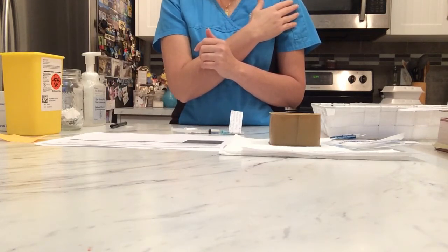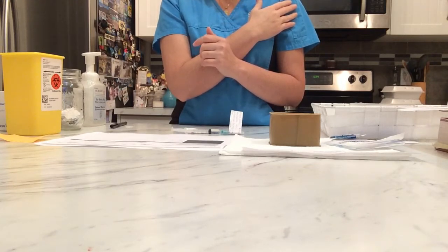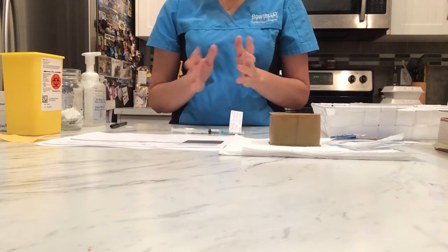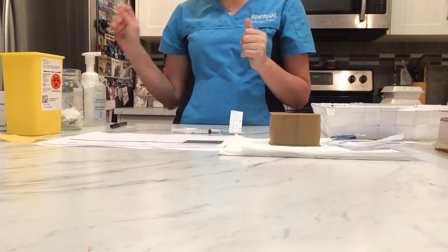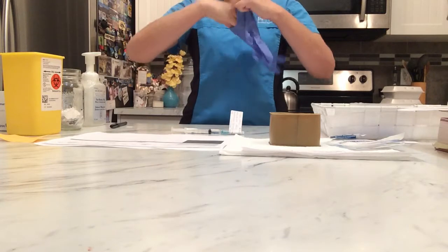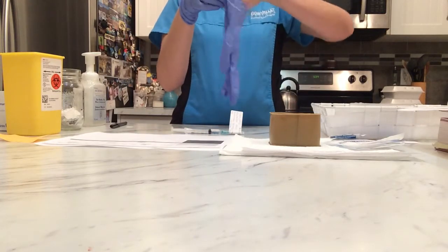This medication will make him a little bit drowsy, but it's normal for this medication. Okay, first I will grab some clean gloves. I'm going to assess the site of the injection.